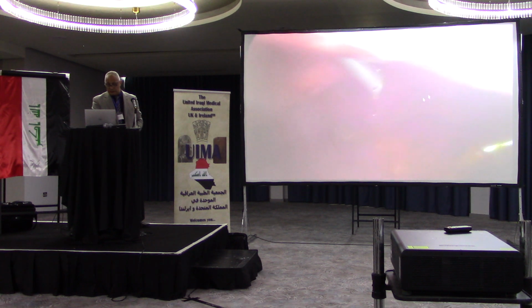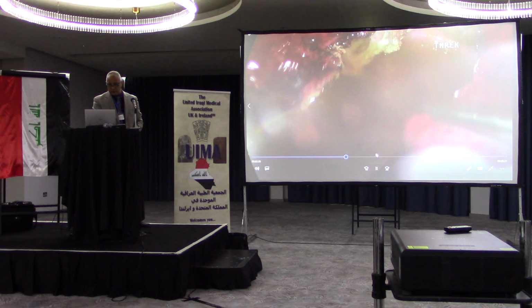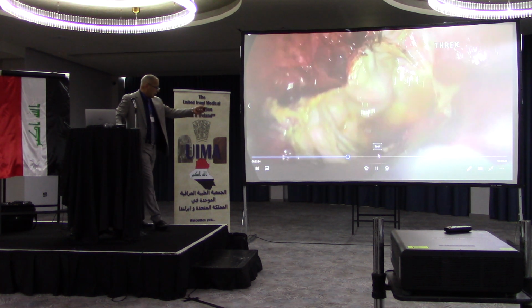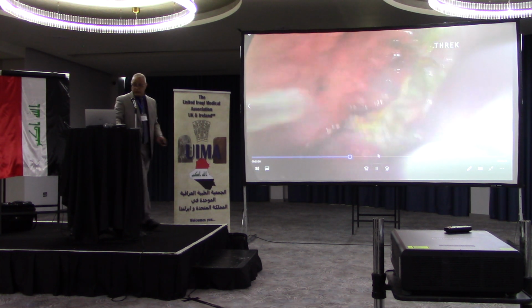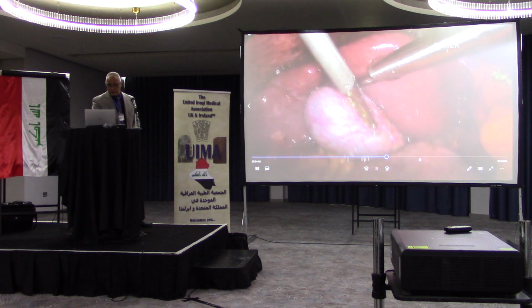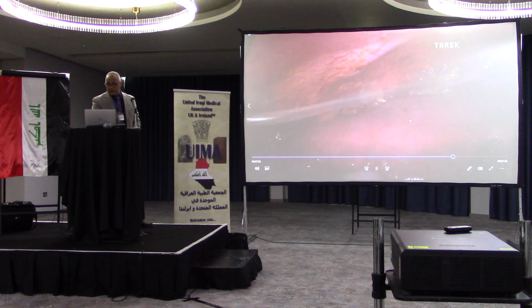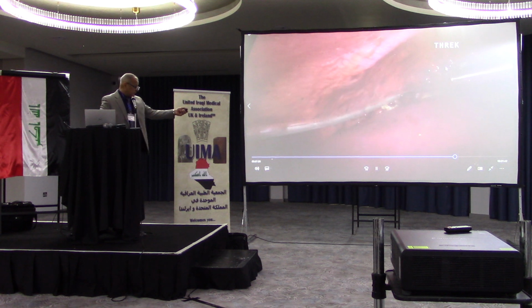This is one of them. Here, after washing and cutting, the main cavity could become one cavity. I put the drain inside, and after that we remove all the rest. This is the drain I mentioned.